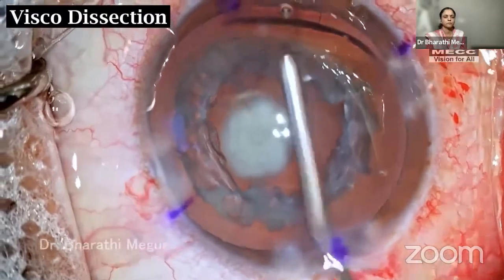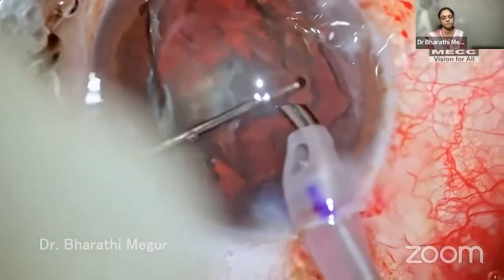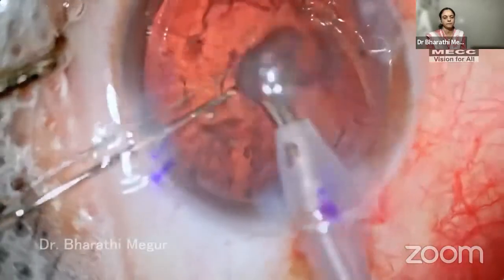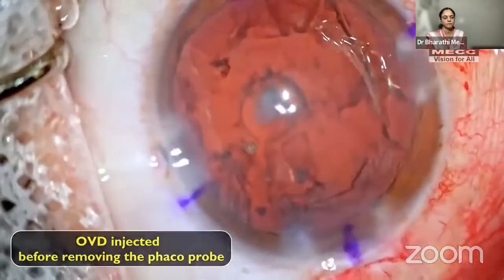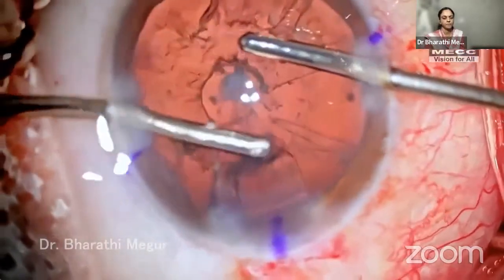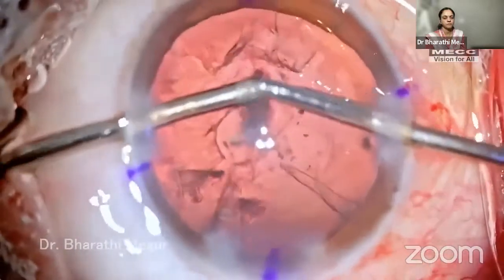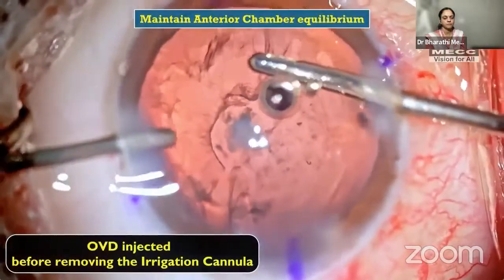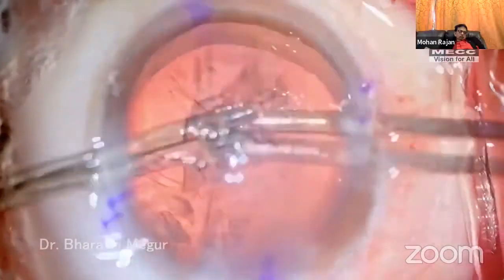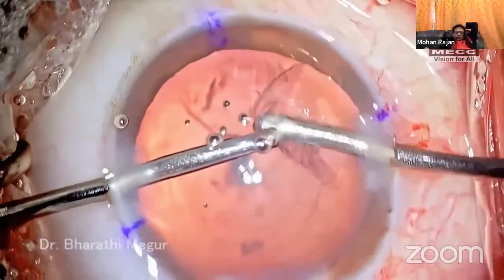We have a central bowl of epinucleus and cortex. Fishing it out of the capsular fornices can be challenging. I prefer to use visco-dissection to separate the epinucleus and cortex from the capsular back. Using OVD, the epinucleus is displaced away from the capsular fornices and gently aspirated in a very slow and controlled manner. Using bimanual irrigation aspiration cannula, I remove the remaining cortex. The epinucleus and cortex removal consumes much surgical time as we need to be extra cautious, and the chance of breaching the posterior capsule is quite high. Parameters are kept low throughout.